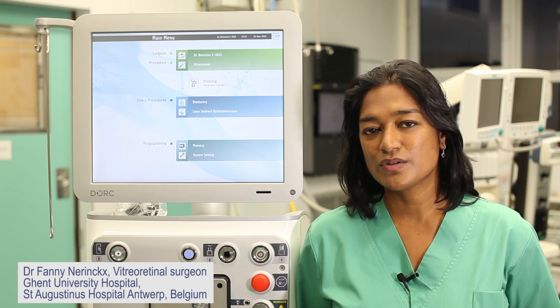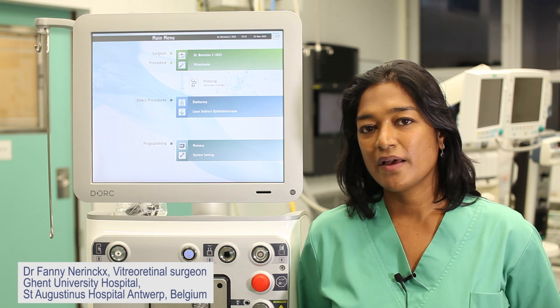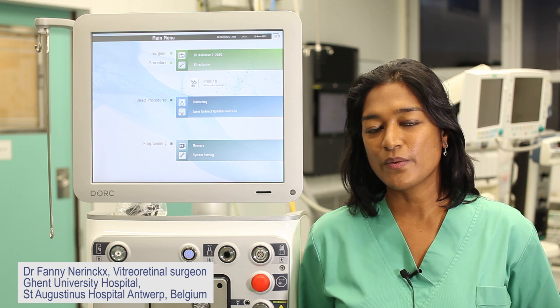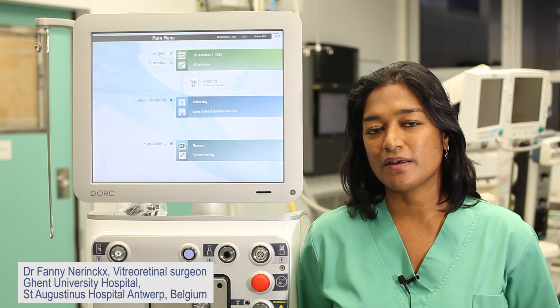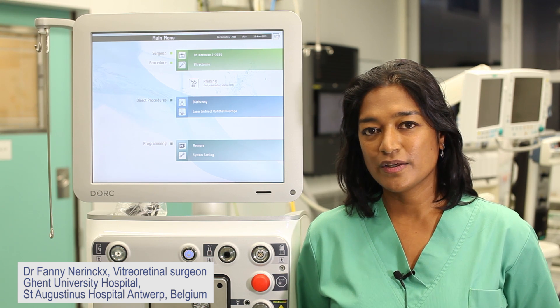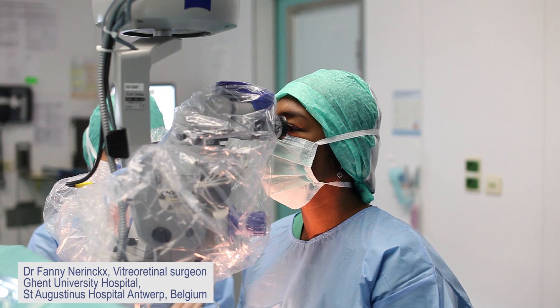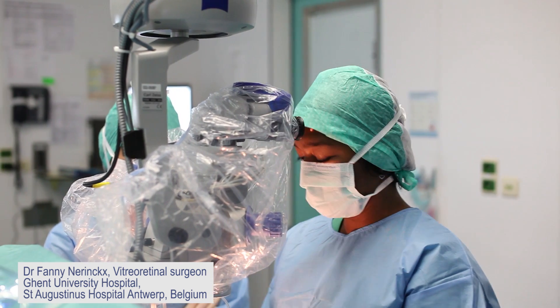You can also use the cutter as a scissor. In flow mode, you can reduce the aspiration to very, very low and use your cut in a single cut mode, so you can use it really like a scissor. It feels very safe and comfortable.